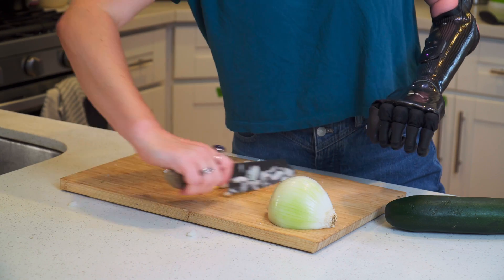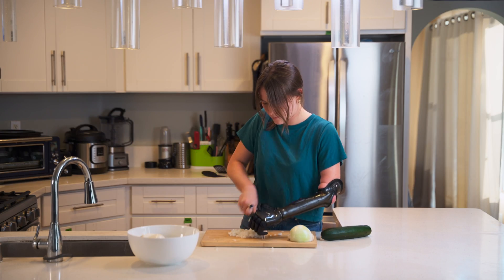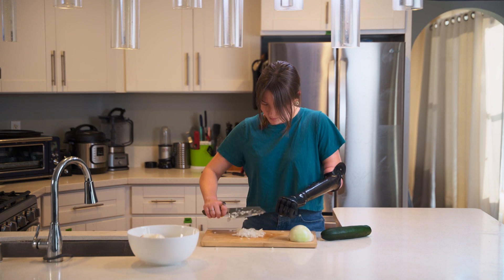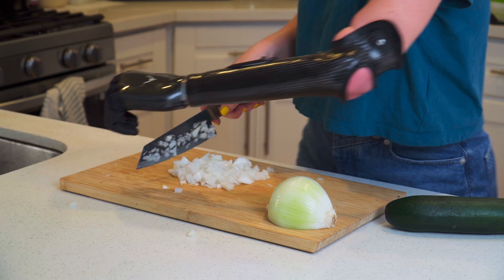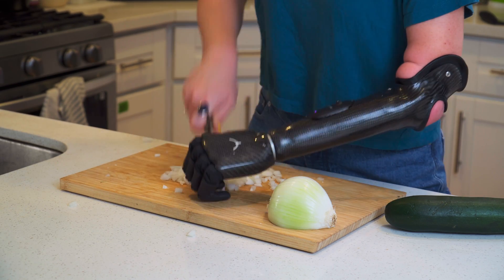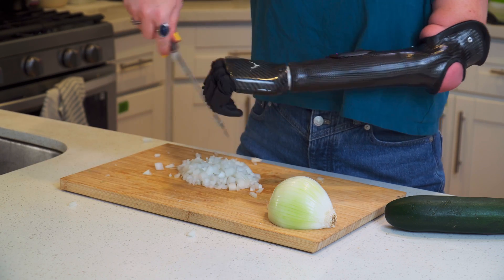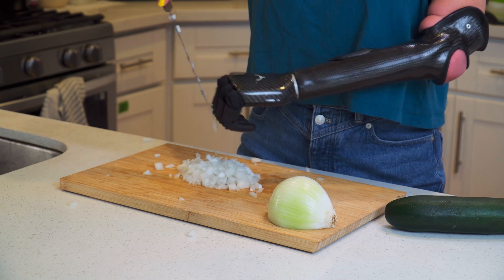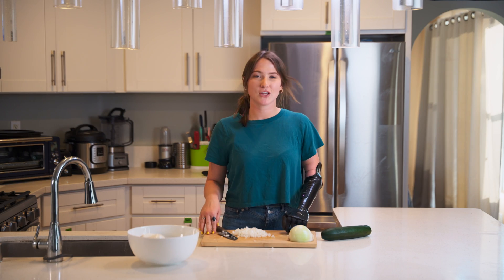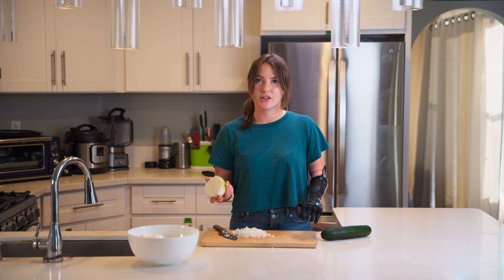All right, so that is some finely cut onion pieces — so that's how I would cut an onion, or any fruit or vegetable item of this shape.